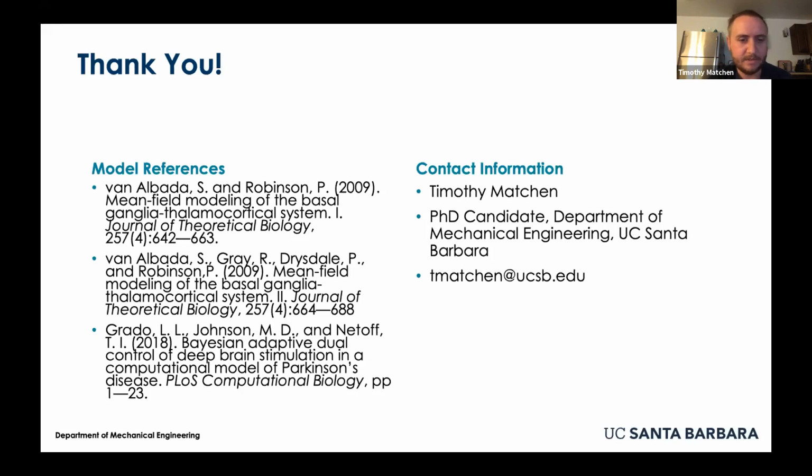I think that it can do a lot of similar things and it can reach the same endpoint. But one thing I like about doing things like autoencoders compared to doing Koopman is I don't need to have a specific form for what I want the correct answer to be. I don't really care, in this case, about analyzing specific modes. I don't really care what the primary mode is so much as I want a network that's going to find data that's going to be useful to the specific application that I want.